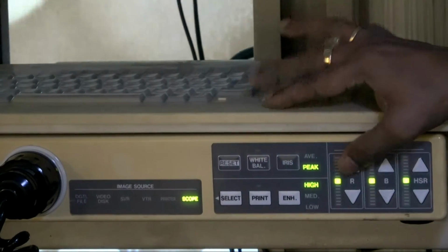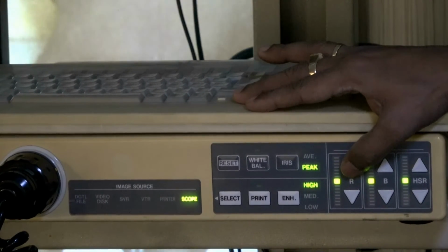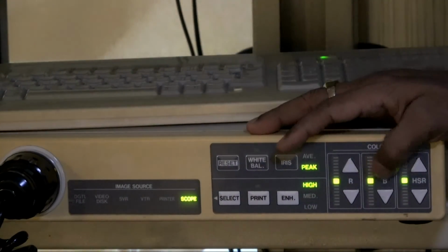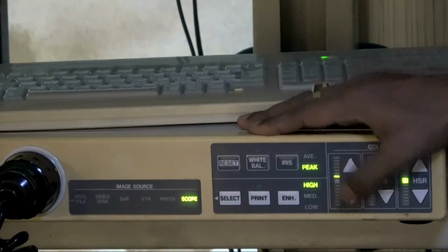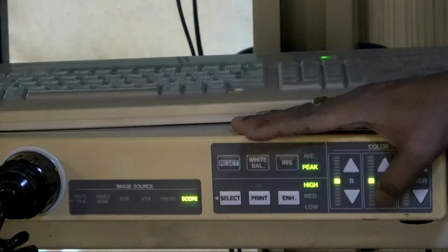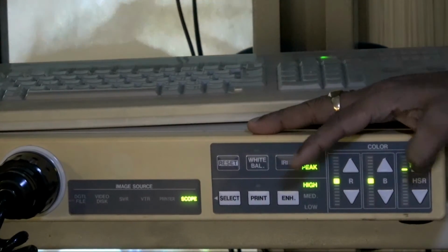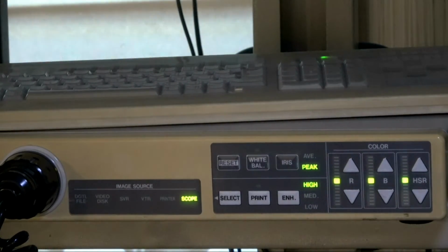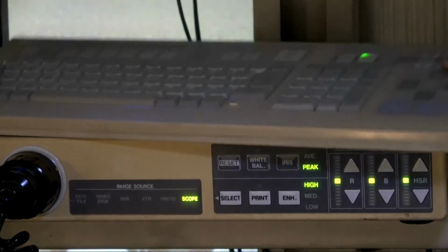And this is manual color saturation. As we know there are 3 basic colors, red, green and blue, so you can increase and decrease any color. If you want to increase red, you can increase it; blue or green, you can decrease. And this is HSR, that is hue saturation ratio. If you want the color to be more saturated, you can increase or decrease it. So this is how you will do it. After that, I will demonstrate how to program it for you.